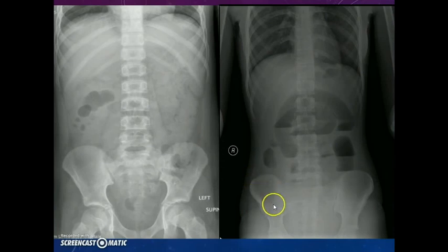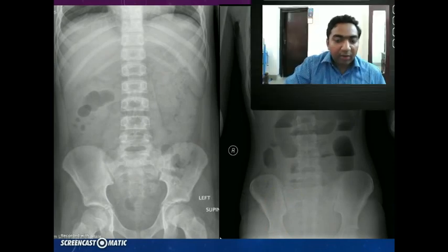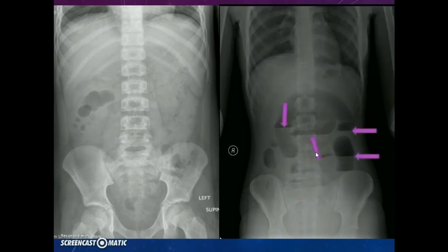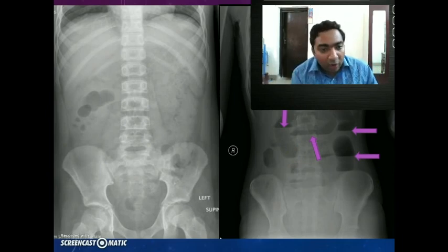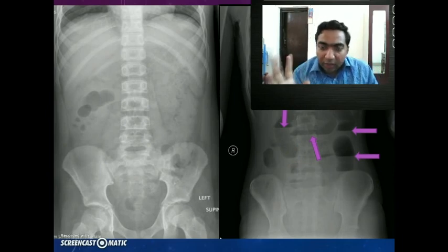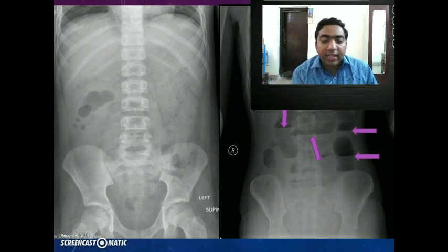Now you see this X-ray. On the left side we have a normal abdominal X-ray erect, and on the right side we are seeing multiple air fluid levels. When will we see air fluid levels? Do we see air fluid levels always in a normal X-ray or is it only in pathology?